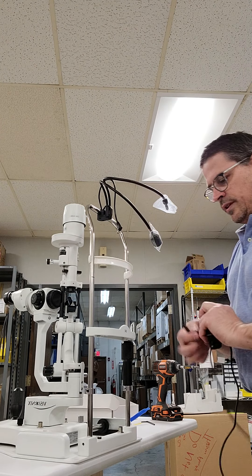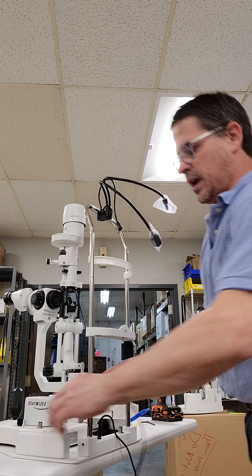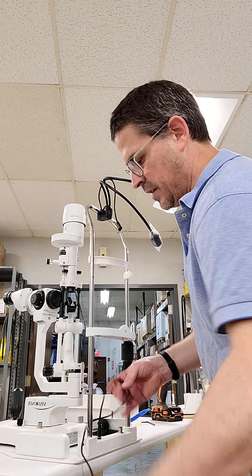You have your power cable — this is the power for the slit lamp. It goes right here in front of the chin rest. You're going to route your cable so it's out of the way of the patient. Going around this side would be best.